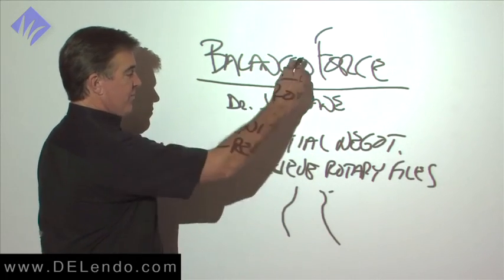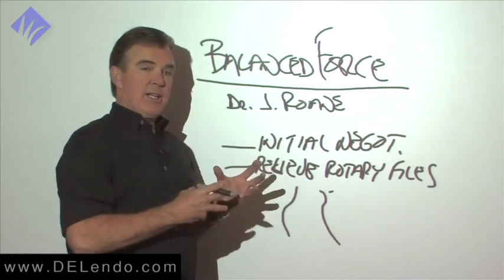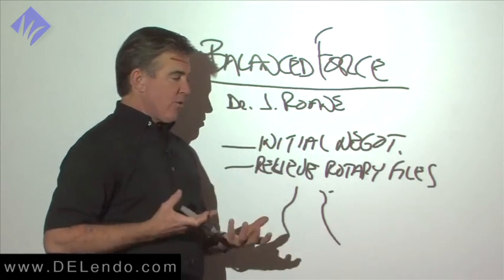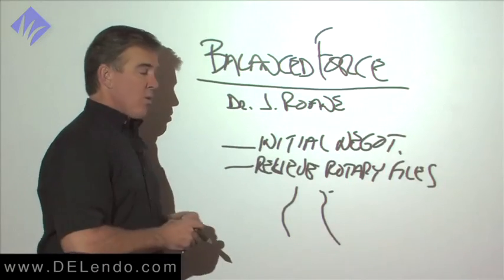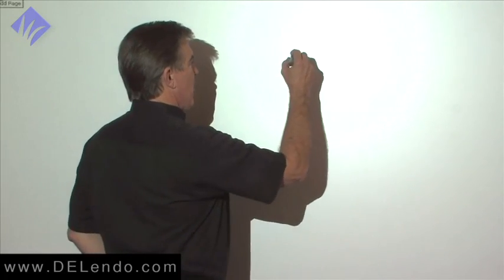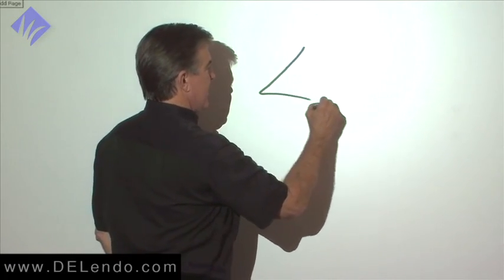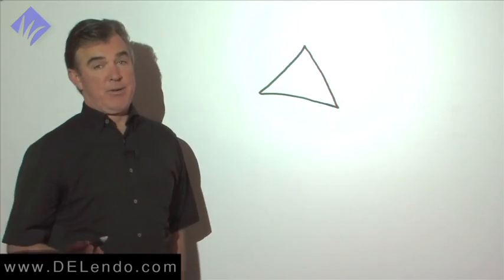If you just use the balanced force technique with a couple of nickel titanium K files, everything's going to be sized up and the rotary file will have less binding and be more likely to get to length. In some cases, we're going to use it to finish the shape with, for instance, a hand GT file. Okay, so what is the technique? The technique is one that is fairly much the opposite of what I was taught in dental school.